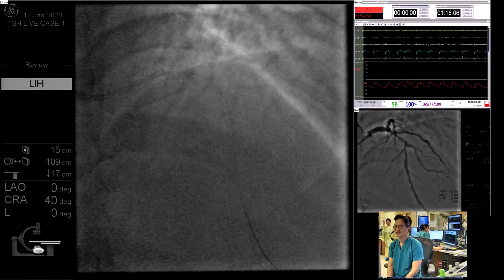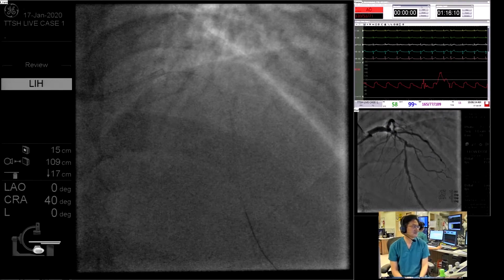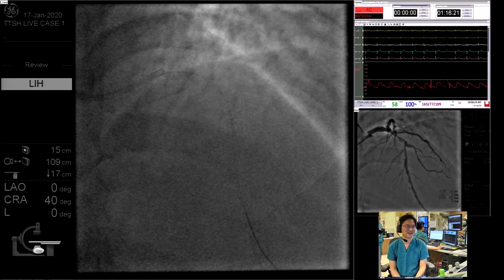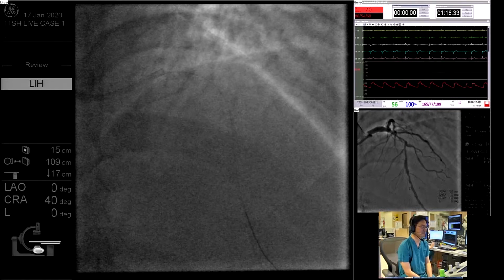Paul, you must be so confident. You can talk at the same time while doing this. I was looking at that, and I said, if we were actually on the case, to see that difficulty with the stent not going down, the guide kicking back, the wires, there's a complexity of how the hand and the eyes move, right? Like what my colleague on the panel here said, we rotate the guide, we control the wire, we try to twist the stent. How do you do that with a robot?